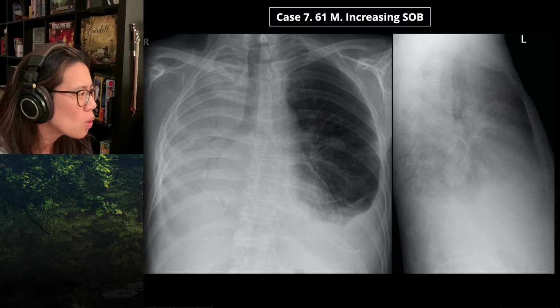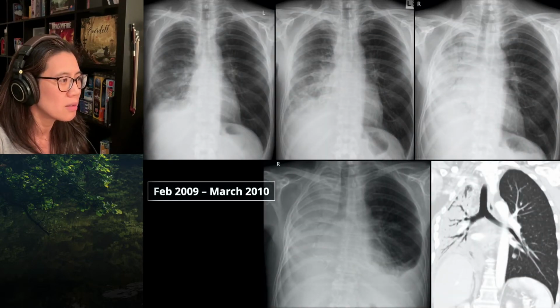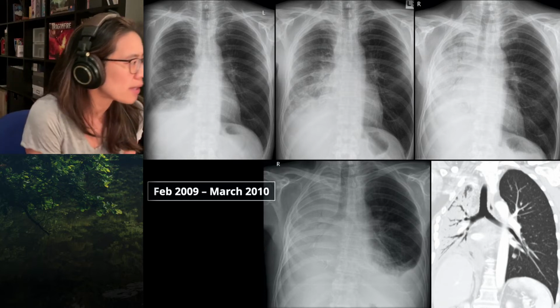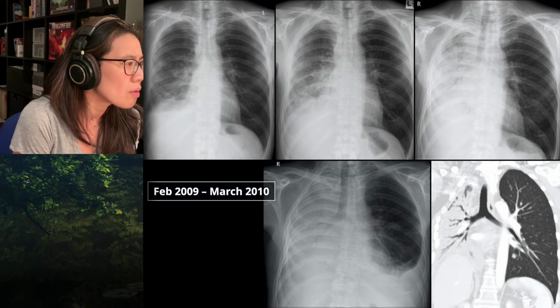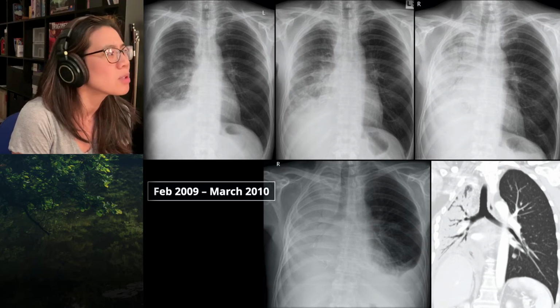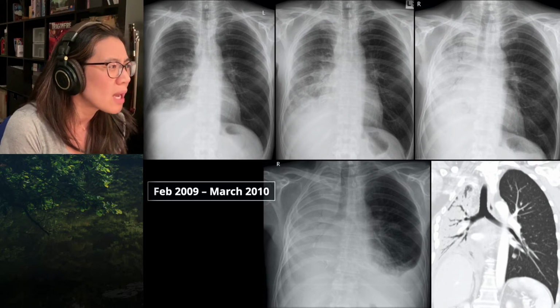All right. I'm not sure what the cause is. Is this chronic? Next slide. Oh, now you're going to tell me. Okay. There's a series of X-rays over a year. Okay, so looking at the initial X-ray, there was loss of lung volume on that right side, and what you don't appreciate is that there's pleural thickening going up to the right lung apex, and there's all these sort of rounded densities projected through the right mid and lower zone.